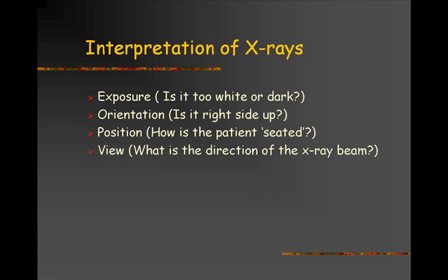And it is also important to have an idea of the particular view that this X-ray was taken in. What was the direction of the X-ray beam? There are several standard views in radiological practice.